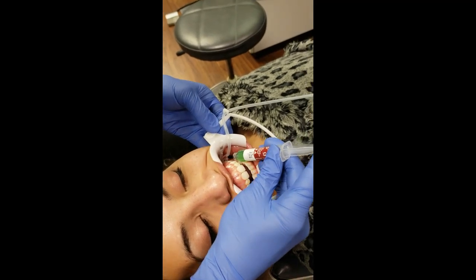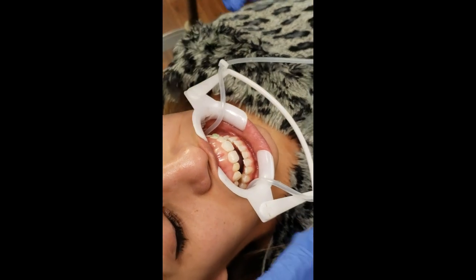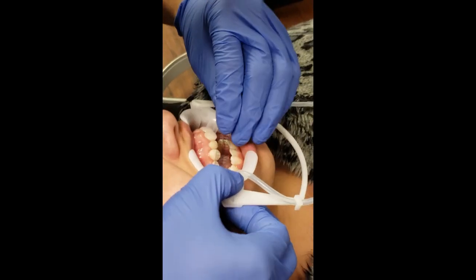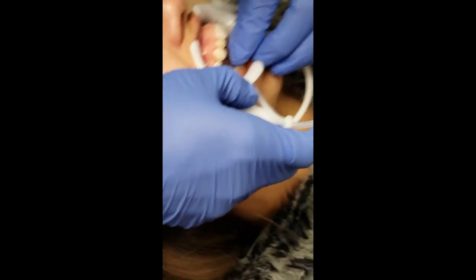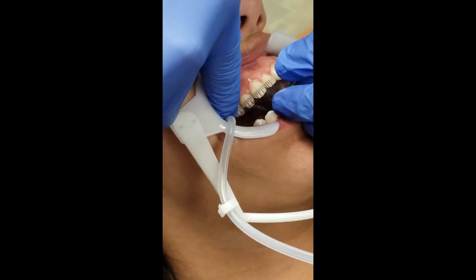We already pre-measured these appliances. I'll show you on this side for the sake of the video how we get our number. We line up the first molar - that goes right in the buccal tube, in the middle of the upper six - and then we get the center of the canine. It looks like about 25... let me measure again - 27. The first time maybe I slid it up. So that's a size 27.